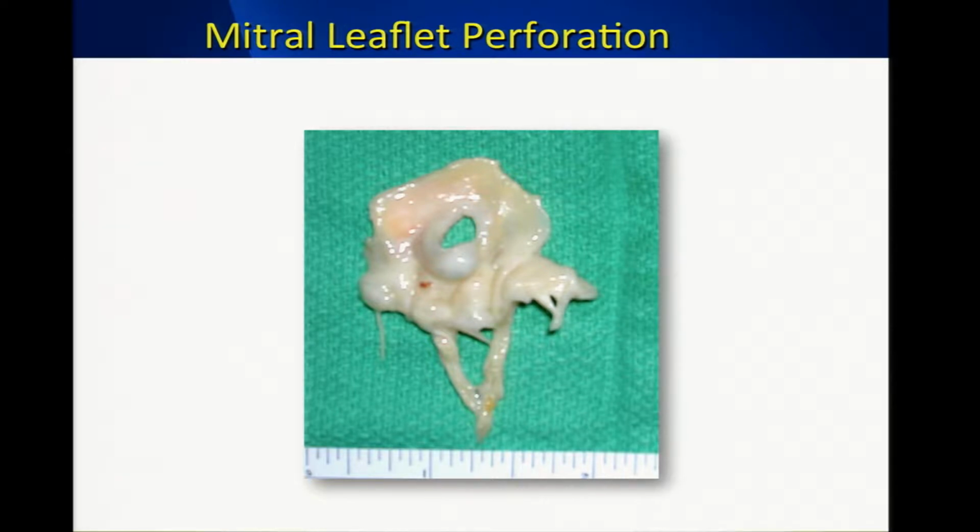So an aneurysm or a perforation often starts with a windsock. It's a weakening under flow conditions. It stretches and stretches, and then it pops a hole through the toe. So that's typically what a windsock deformity is. So it's a long tunnel. Sometimes it can be a short tunnel, like in this particular image, and then a perforation through the end.